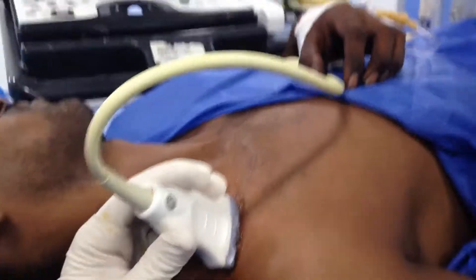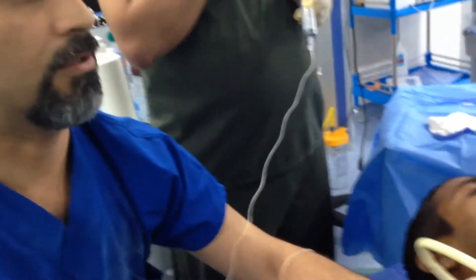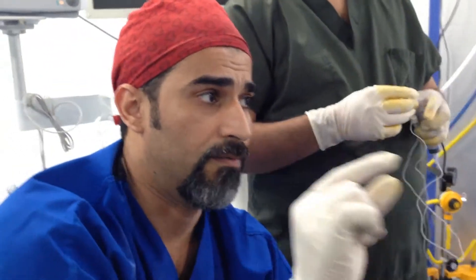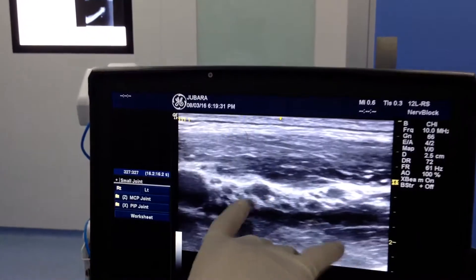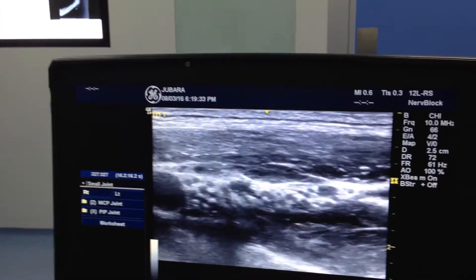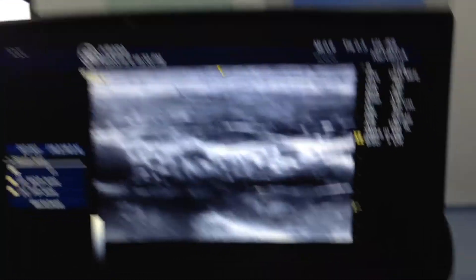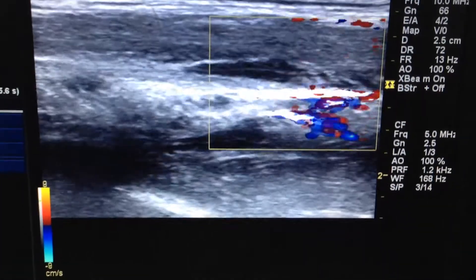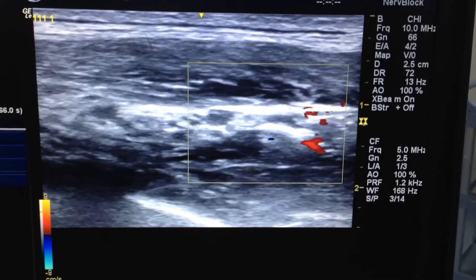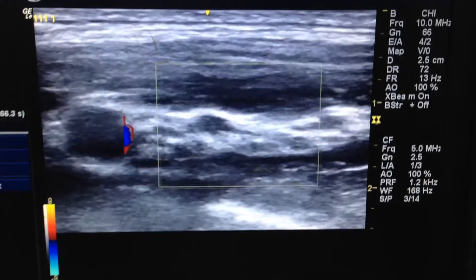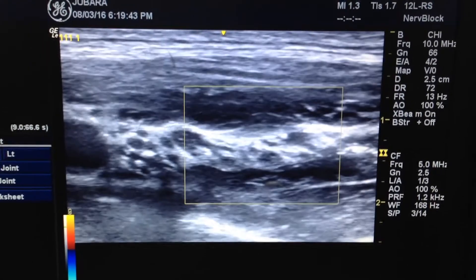Now the brachial plexus block is done, but we should differentiate between the vascular structure and the trunk. We confirmed the same shape of the trunk in this patient to avoid any intravascular injection and complications. Now this is the brachial plexus block — we are away from the vessels.